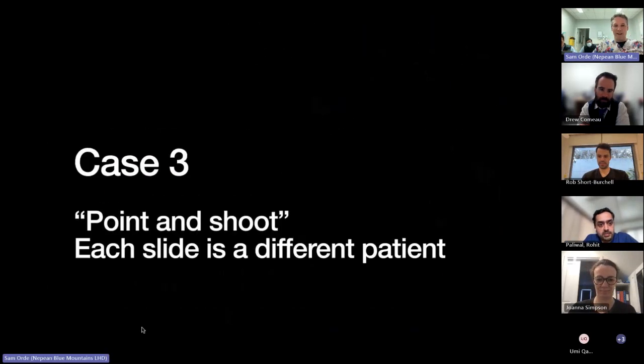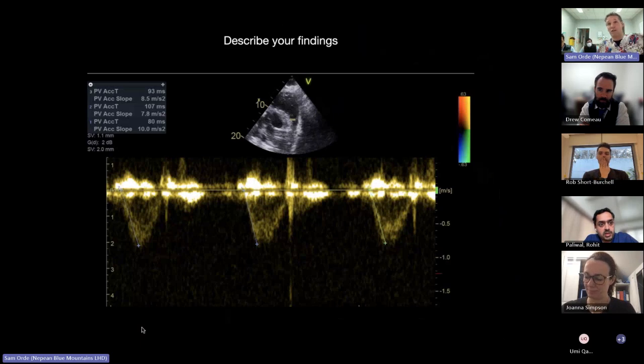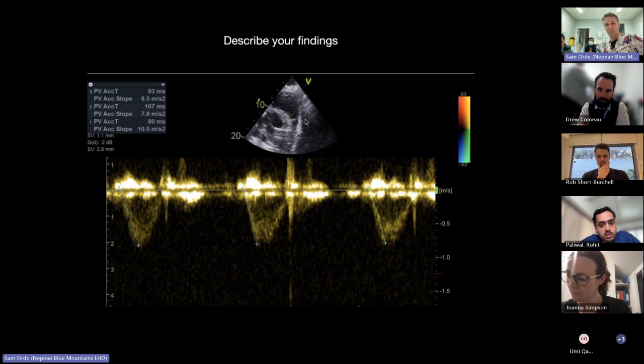Very nice. Okay, nicely done. A few things to work on, I think, but I think it would have been a pass. But again, not passed well. And I think we've got a few things to just tighten up. So on this first profile, really nice. You're picking, obviously, we're in the RVOT. You could talk a little bit more about the trace. You got a closing click, which tells us that we're in the right spot for it. You've got a low pulmonary acceleration time.